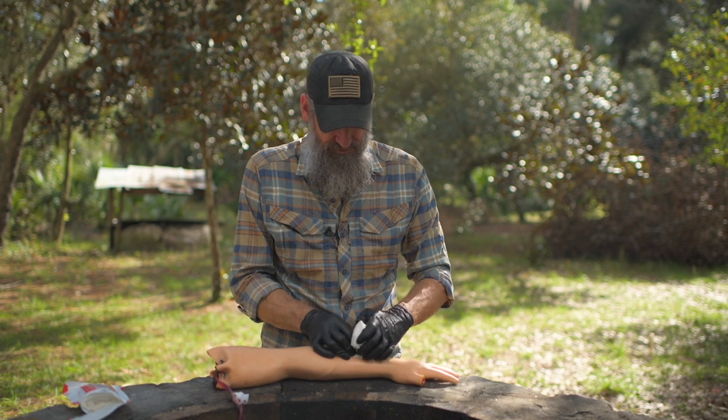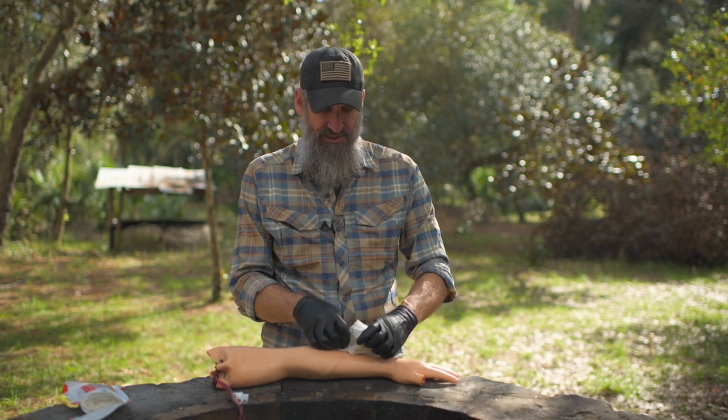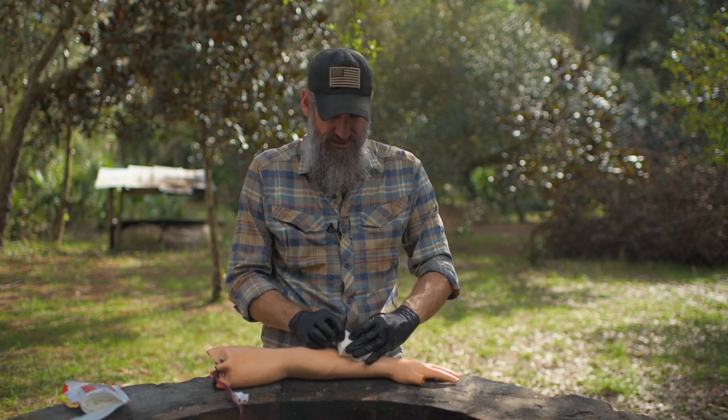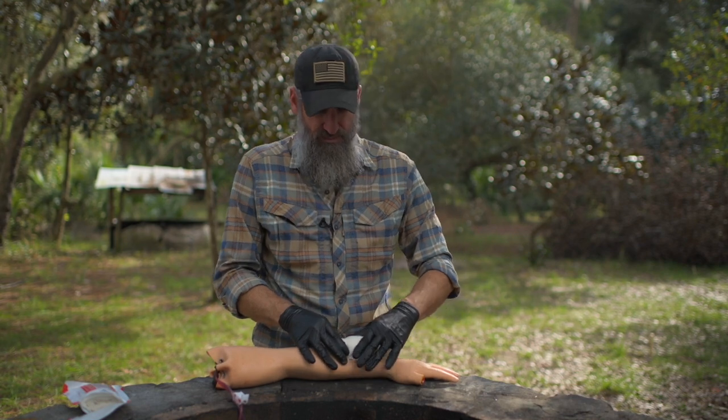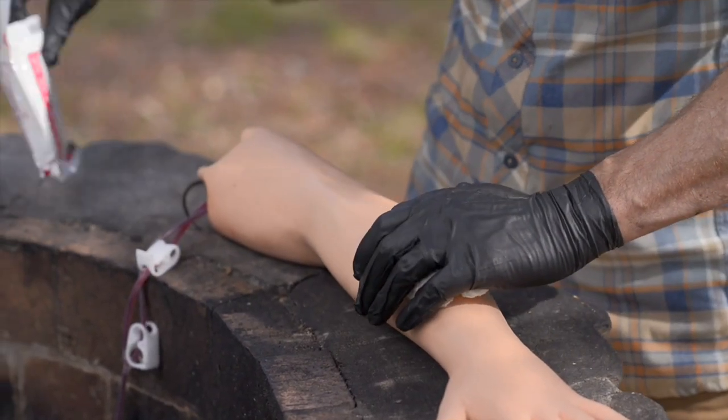And then whatever leftover material you have, you want to just place that right on top, and that'll give some additional pressure when you put the pressure dressing on top of it. So that is your wad of material up on top, and you're going to maintain pressure here.